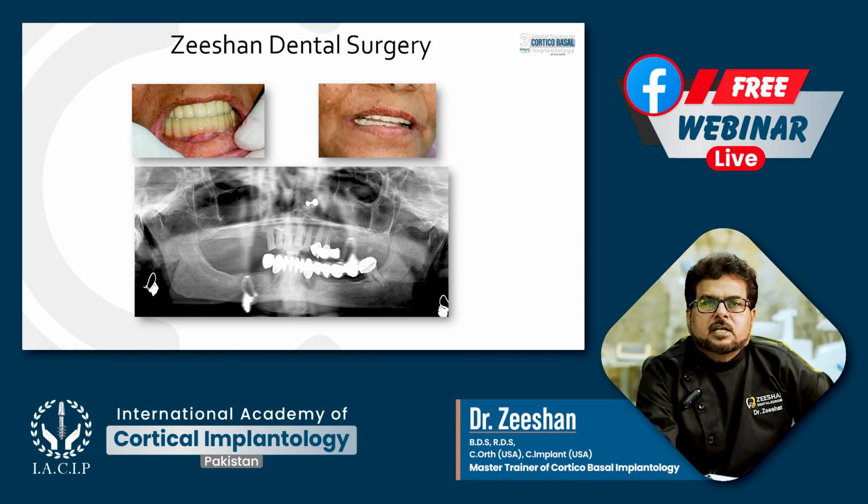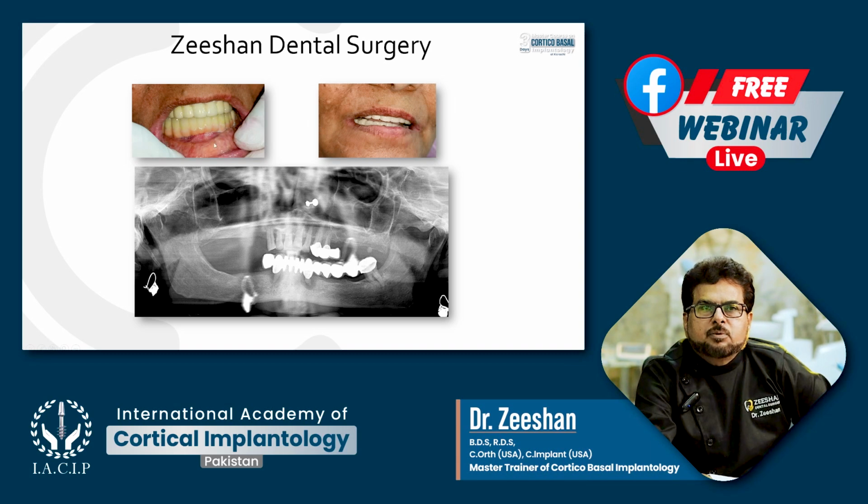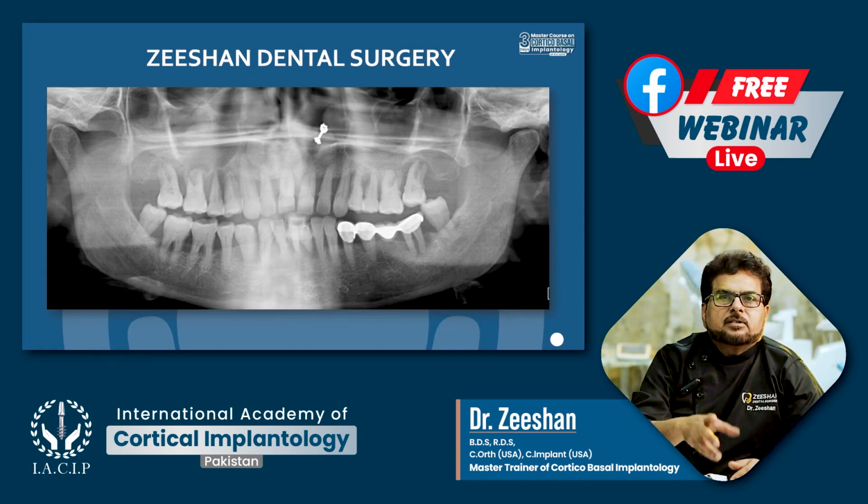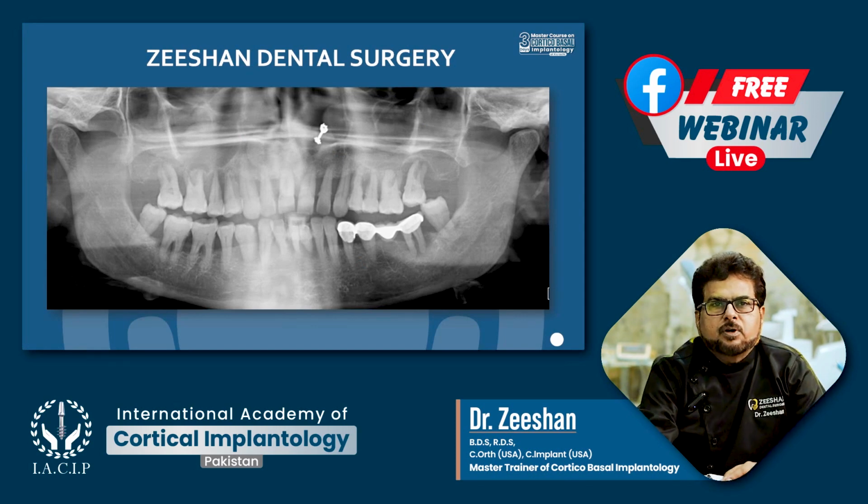Now this is the case which has been restored after inserting the implants, and the patient is happy. Within 72 hours they have provisional teeth, and after healing of the sockets you can change the provisional to permanent restoration.